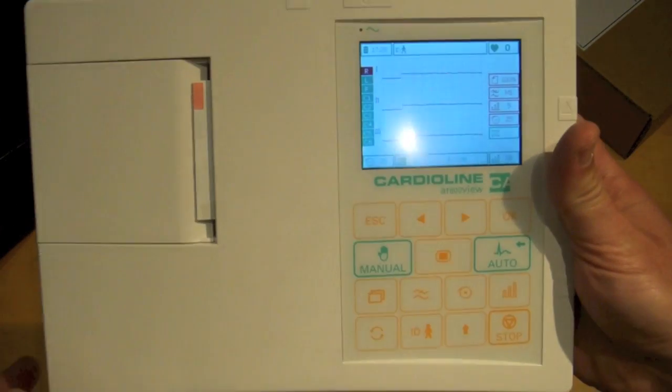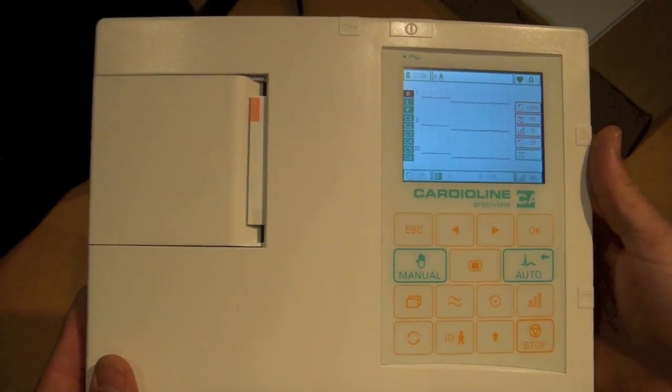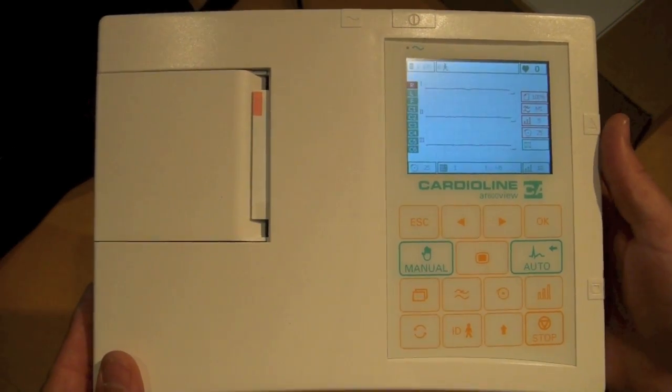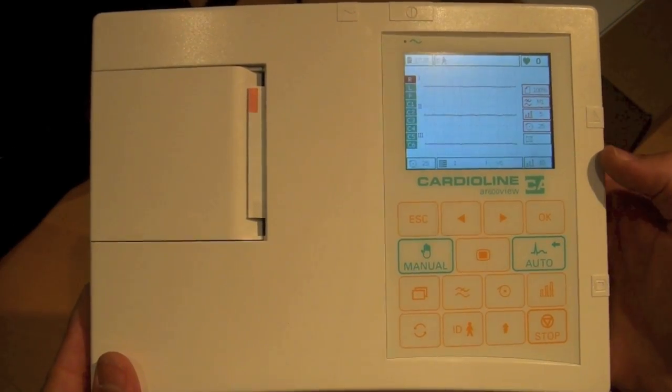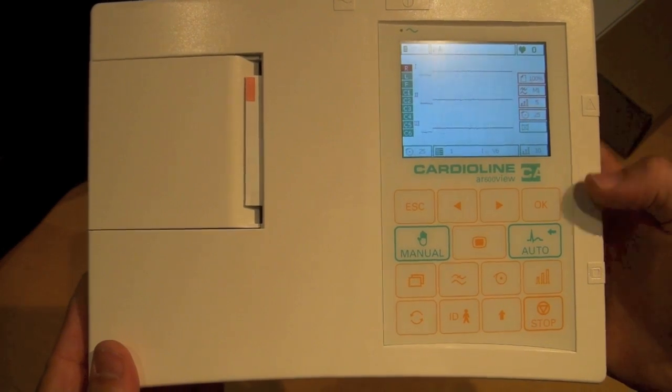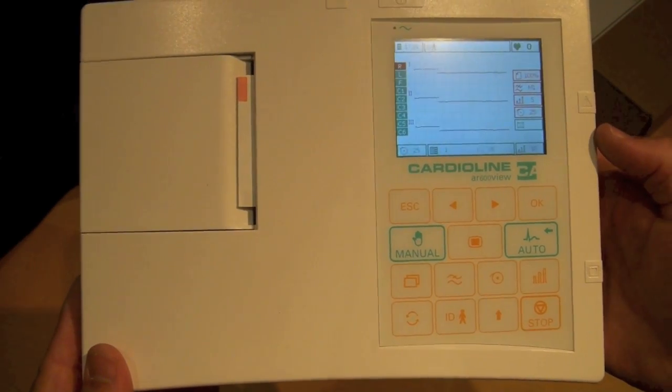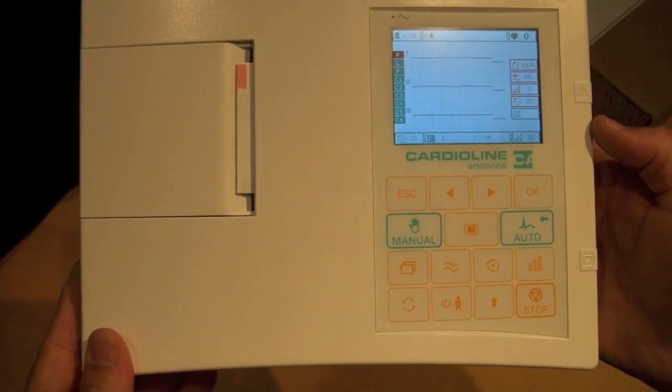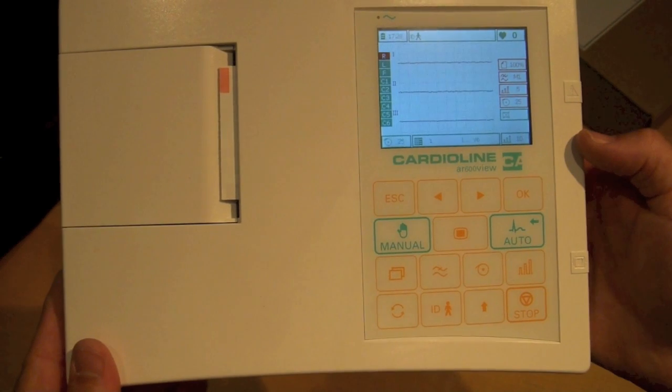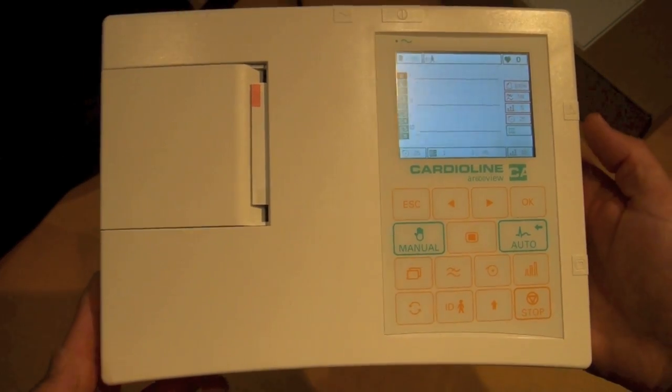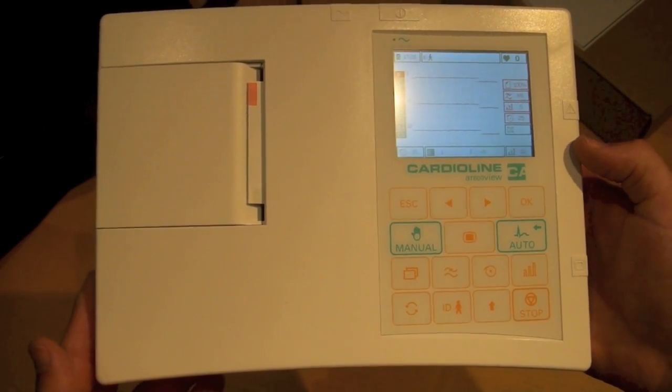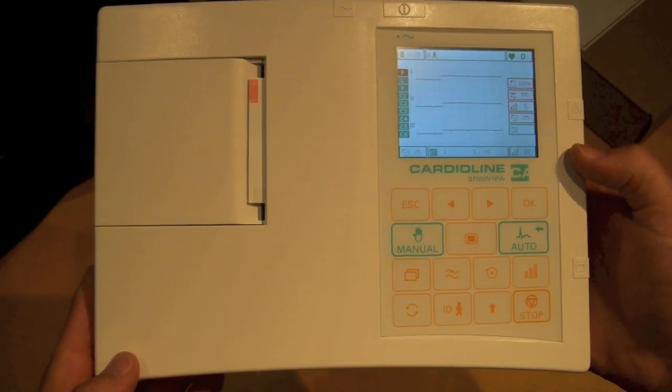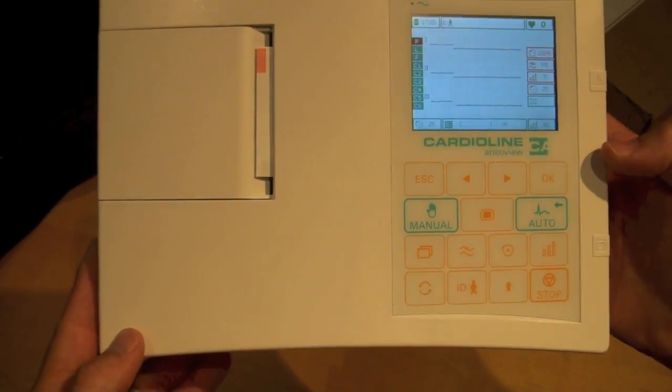So picking up the unit here, it's very easy to use. You can enter patient data if you want to. You can just perform a stat ECG by hitting the auto or manual button. You have all your typical controls for a small ultra-portable 3-channel machine. All of these machines do come with a 3-year warranty, color screen.